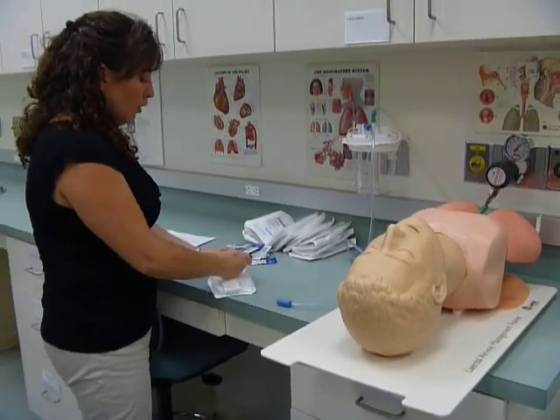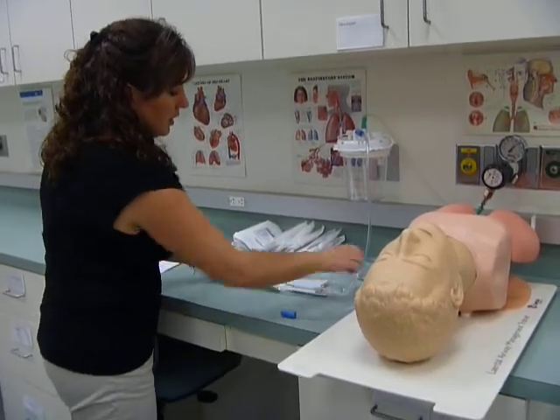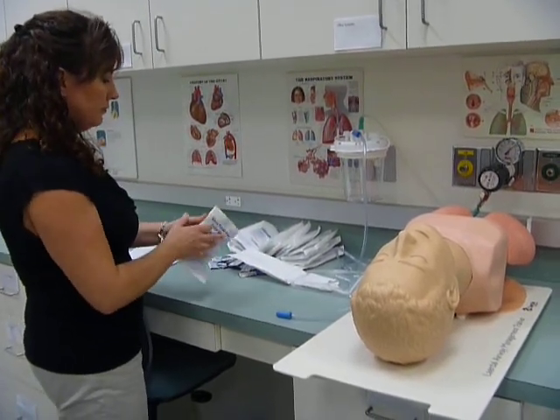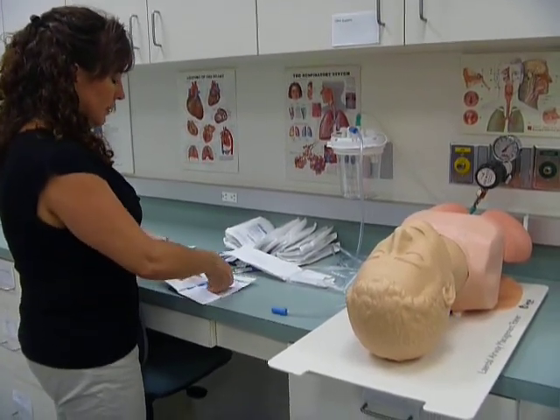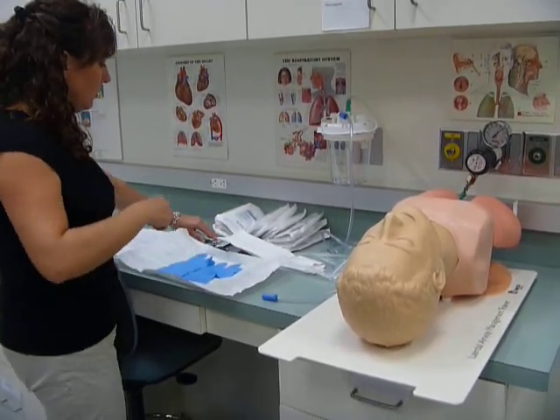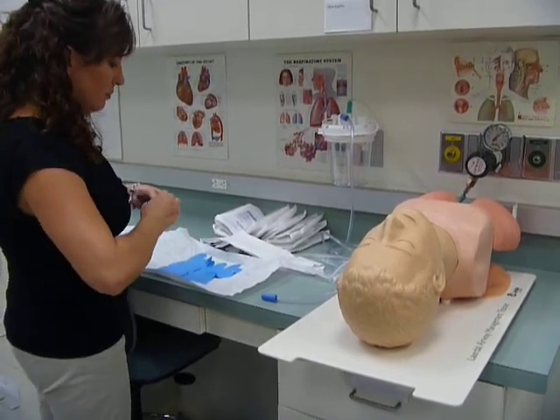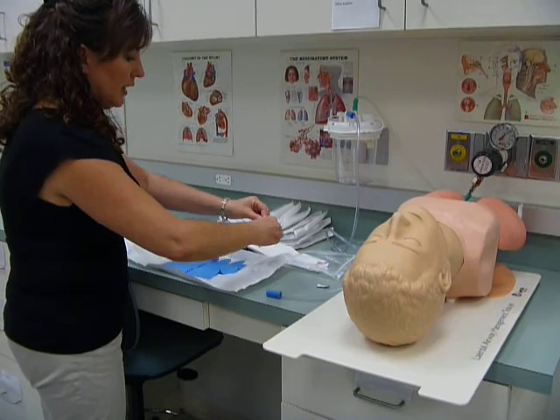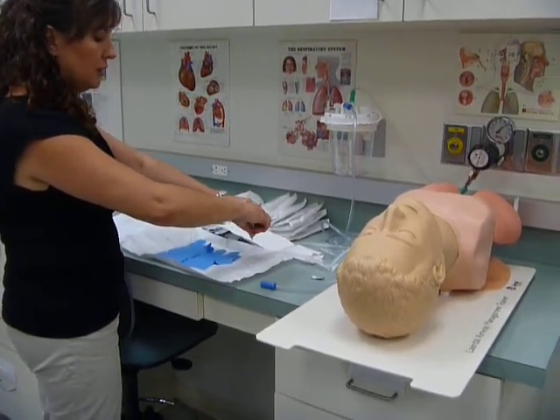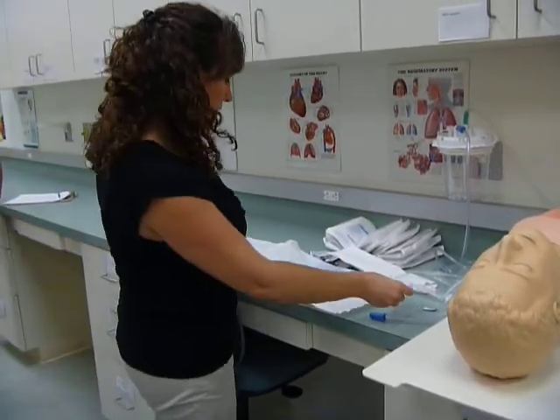Okay, I'm going to open my suction equipment. I'm going to take out my sterile gloves. So open that up all the way. I'm going to open my gloves. Remember, this is my sterile field here. So before I put my gloves on, I'm going to put some lubricant on my sterile field. And again, don't touch anything. Just squeeze the lubricant out onto the sterile field, but don't touch the package to the paper or anything like that.